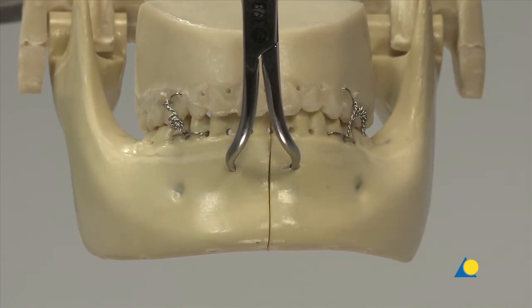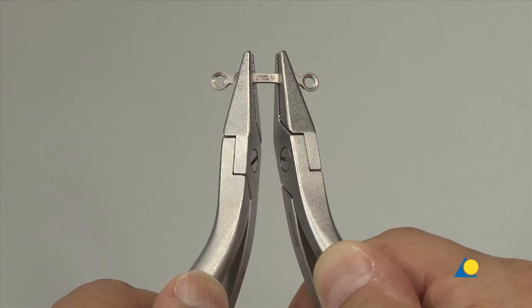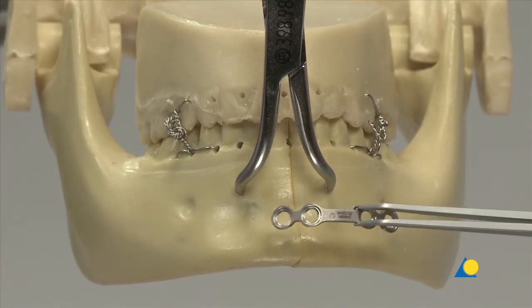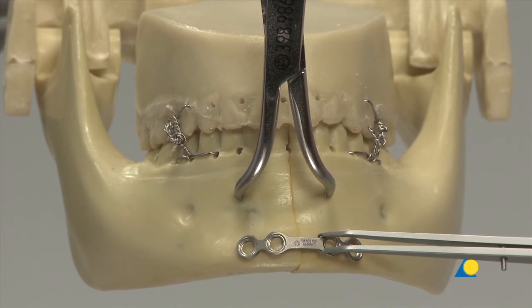This fracture is to be repaired with the two mini-plate technique. The first 4-hole 1 mm thick matrix mandible mini plate is applied to the inferior border of the mandible. The plate is contoured with the bending pliers. The plate is positioned a few millimeters superior to the inferior border using the holding forceps.